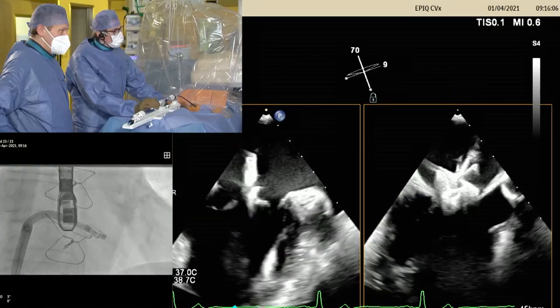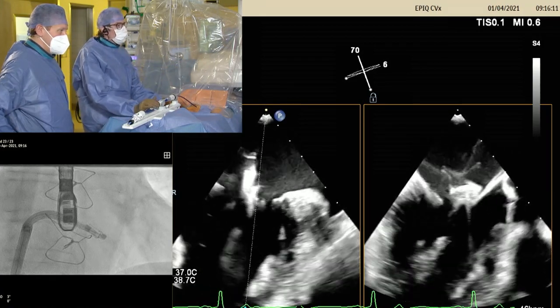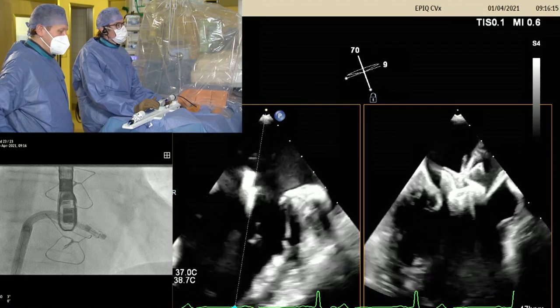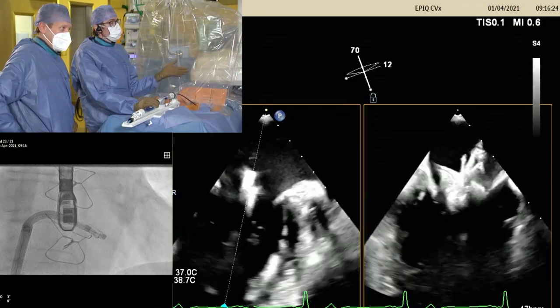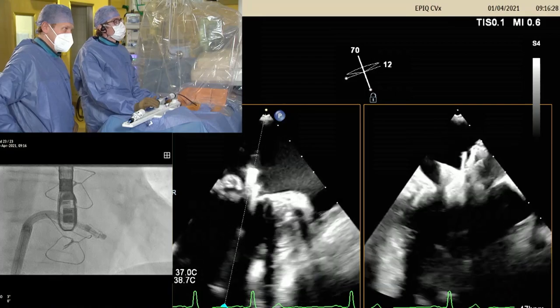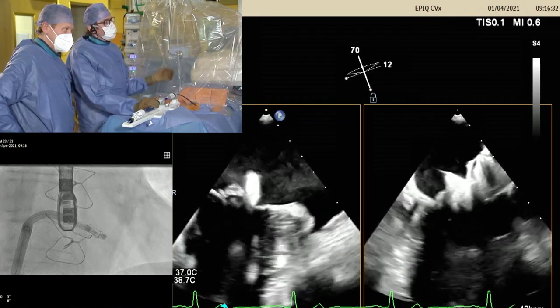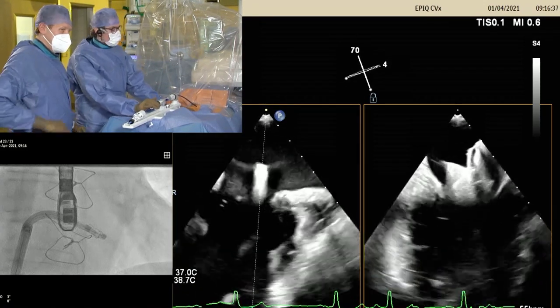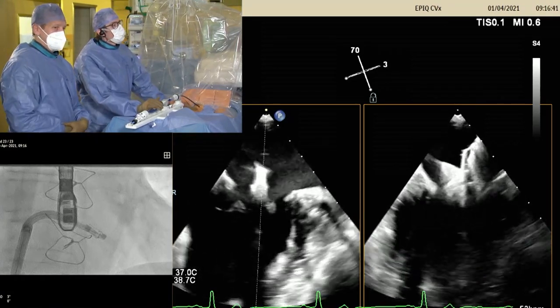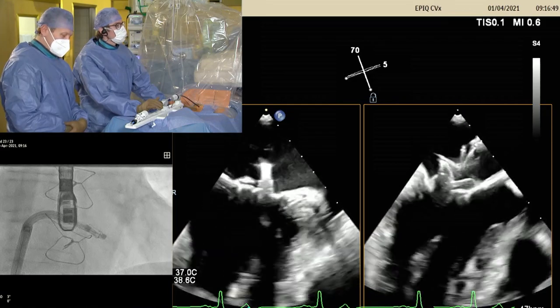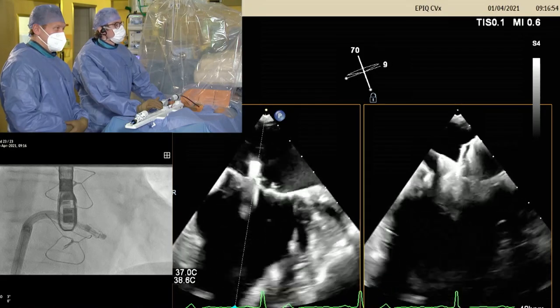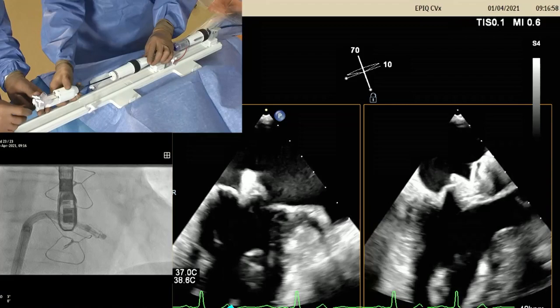The next step is to cross the mitral valve, getting the anterior leaflet in first, then the posterior — especially important in challenging anatomies to place the device exactly where desired. This is done within a breath hold. On echo the device is seen a little too lateral, so a correction is made: an end-expiratory respiratory hold is requested from anesthesia. With expiration the whole system moves medially, correcting the position. The device then crosses the valve.